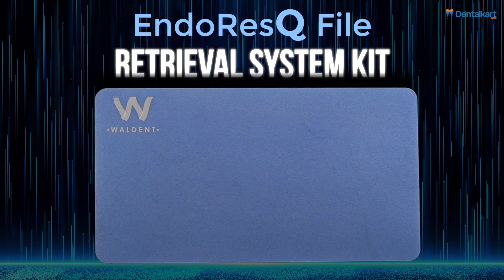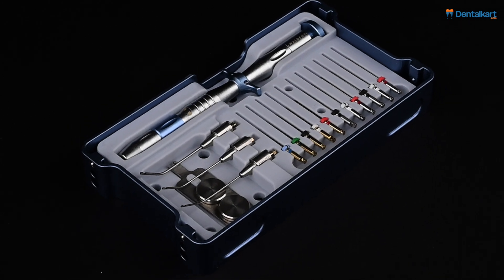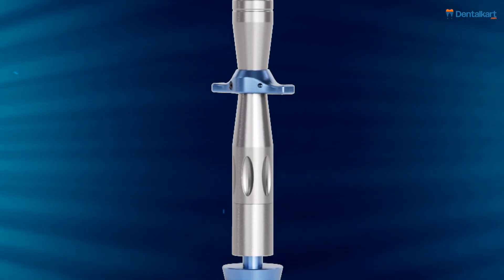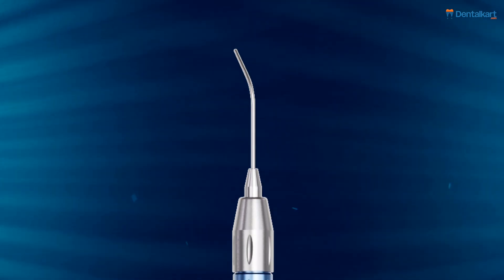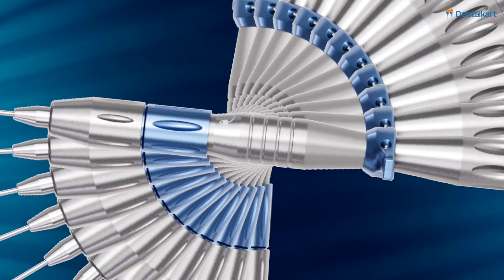The Walden EndoRescue File Retrieval System Kit is an advanced tool designed to simplify and secure the removal of broken root canal files. Its innovative design enhances the safety and efficiency of endodontic treatments, providing dental professionals with a reliable solution for resolving file breakage and ensuring optimal patient outcomes.